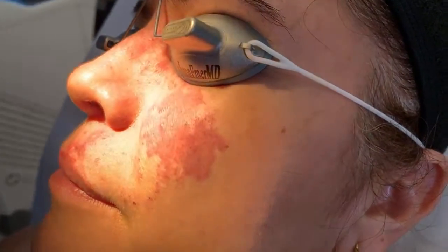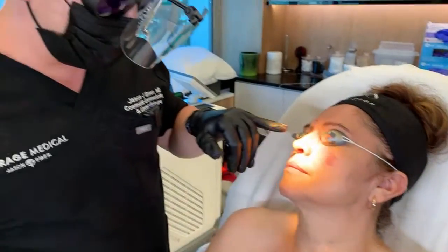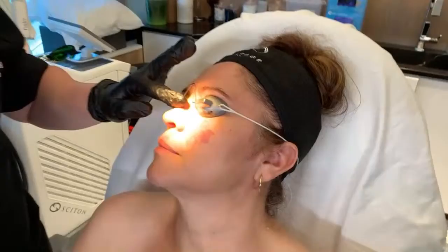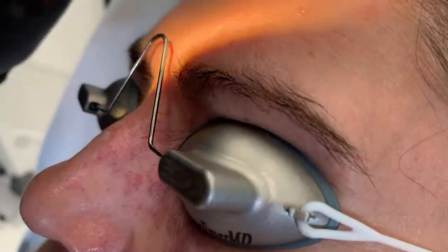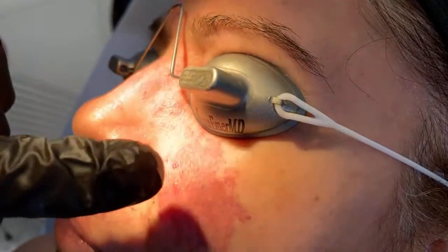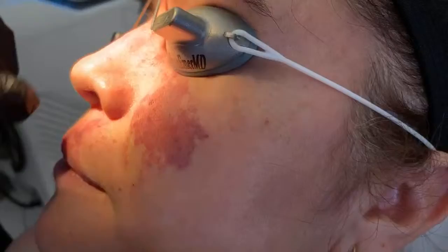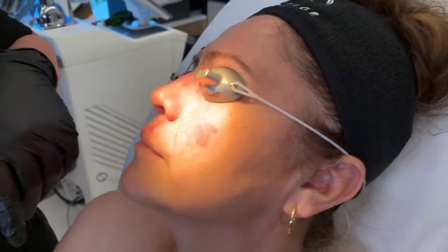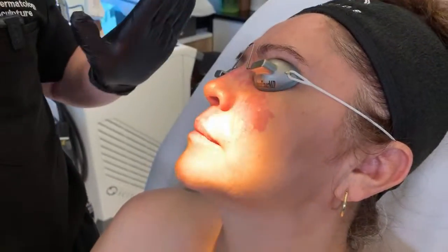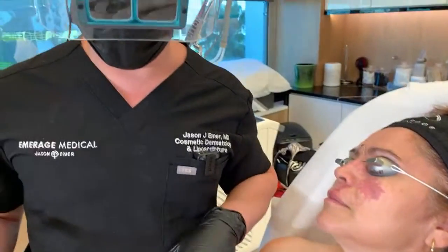What I want to do now is help her get rid of it. This birthmark, when you press on it, actually changes color — that's what we call a vascular birthmark. Over here we call this the hypertrophic area, and over here it's a flat patch, so it makes it more difficult to remove. But we're going to go old school — the gold standard treatment of port wine stains.